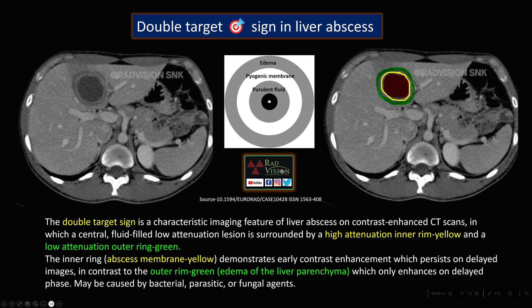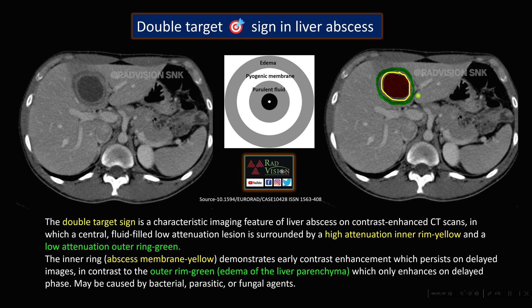Next case: we'll try to see the double target sign in liver abscess. Here you can see this is the liver abscess. There will be a hypodense central core which is surrounded by a hyperdense membrane, which is in turn surrounded by a hypodense rim. This central hypodense area is the abscess, and the yellow one is the pyogenic membrane or abscess membrane, which is surrounded by edema.